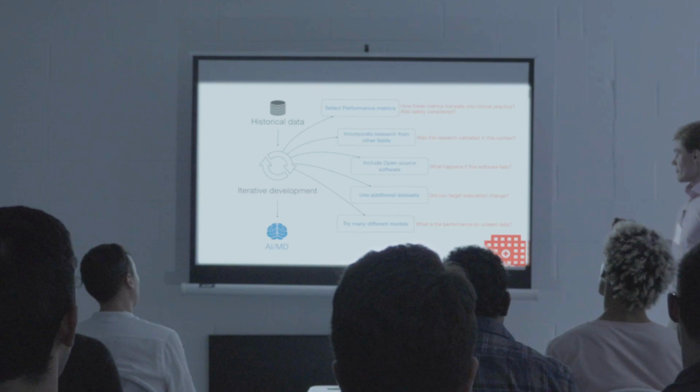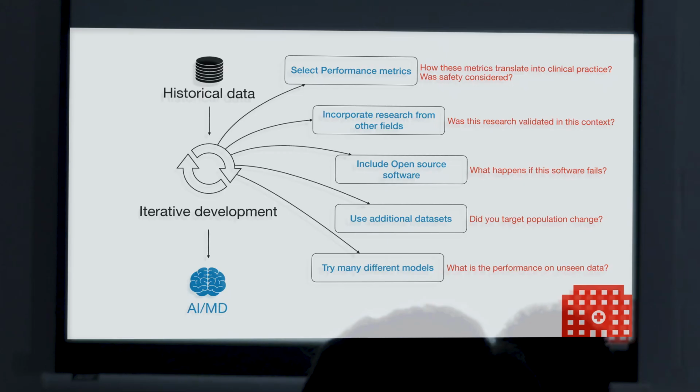And also the most common one, I guess: how will the performance of your algorithm, which you optimized on your historical data or any other data set you brought in, translate into clinical practice after all? There are two competing priorities here.